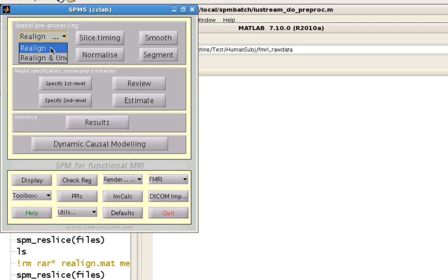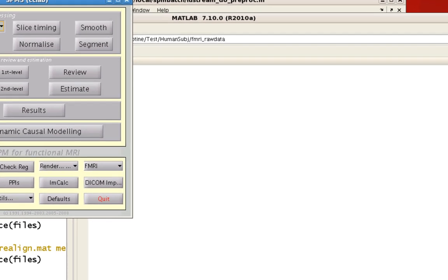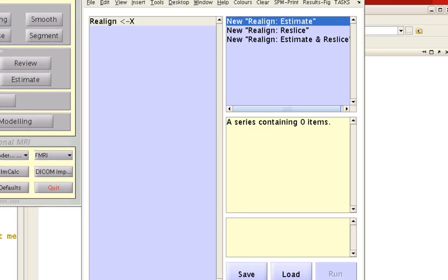For now, we're only going to focus on Realign. This tool takes images within each run and aligns them to the first image of that run. Then all images from each run will be aligned to the first volume of the first run.